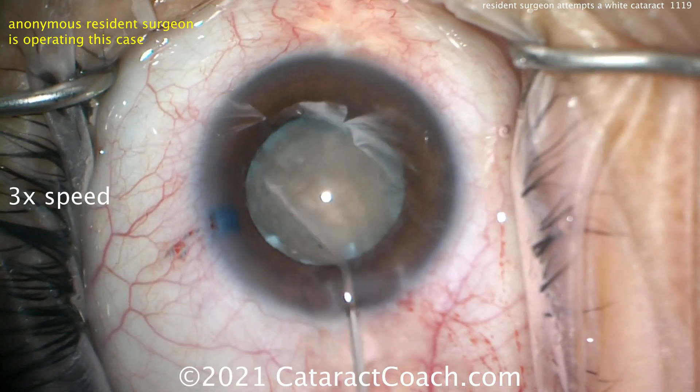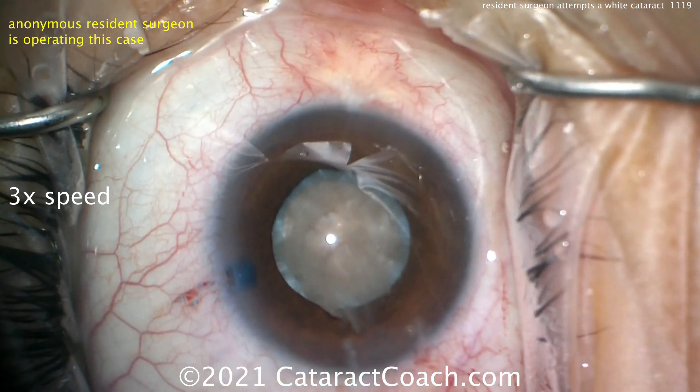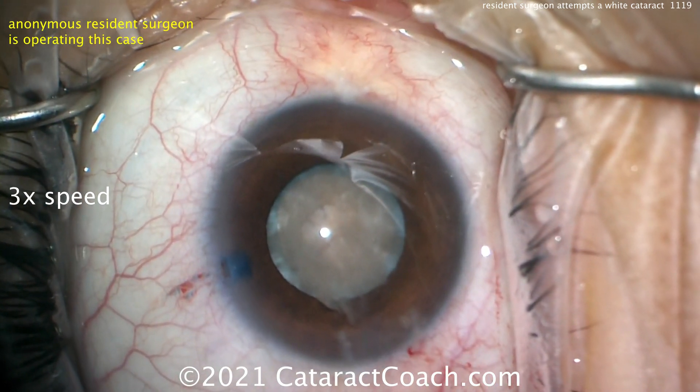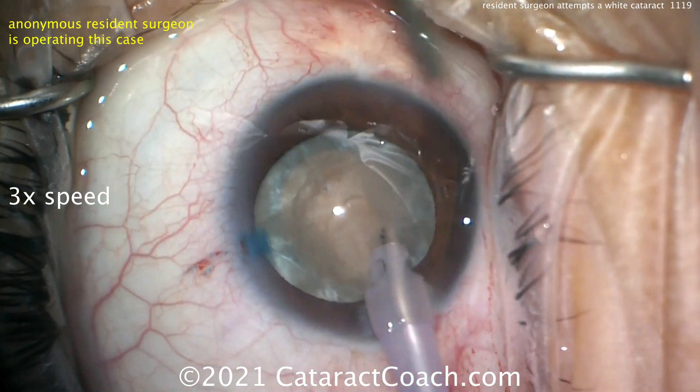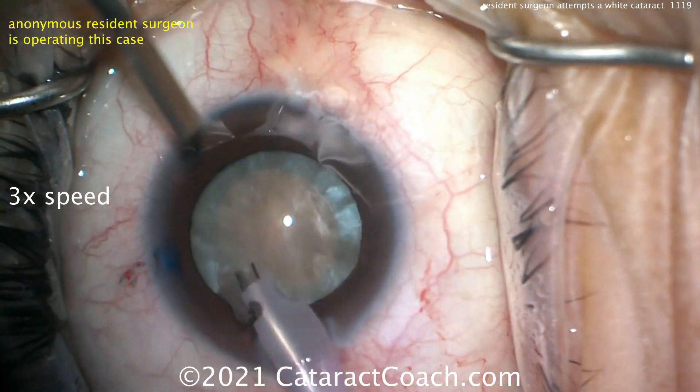You can't see the fluid wave that goes behind because the lens is so opaque. It definitely spins. Remember, white cataracts are often white due to opacification or even liquefaction of the cortex, so these spin very easily — often without hydrodissection. The phaco probe is going inside the eye now.